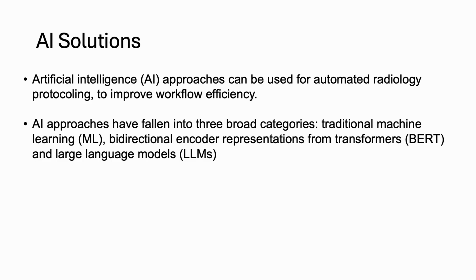And one of the solutions to this problem is the utilization of AI for automated radiology protocoling. In the literature, this has really fallen into three categories. One is traditional machine learning. Two are BERT models, which is essentially a newer type of machine learning model that came out around 2018. And then number three is LLMs, that includes, for example, ChatGPT, Google Gemini, Llama, or DeepSeek. And these are the latest state-of-the-art AI technology.